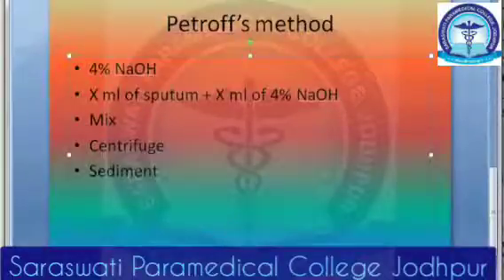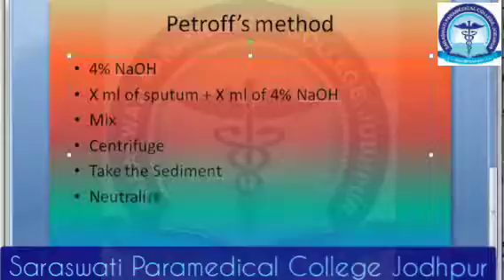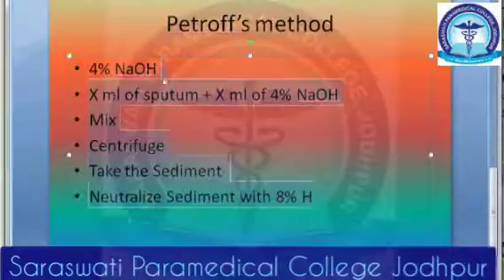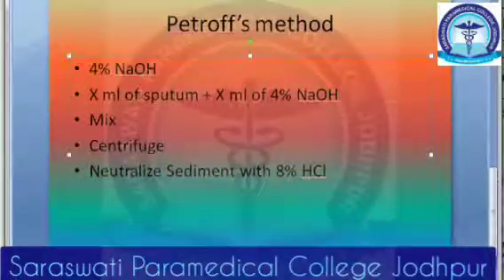Take the sediment and neutralize the sediment with 8% HCl.